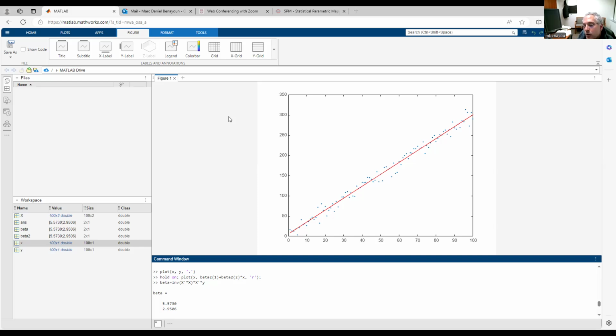In the clinical world, honestly, what ends up happening for me is I have a lot of a priori knowledge, because if you know the functional neuroanatomy, I kind of know where I should be seeing, roughly speaking, language activation, other areas of activation. So I can often just manually and visually change my alpha value and see, if I turn the alpha value really insensitively, every voxel lights up and it looks like every part of the brain is responsible for language.